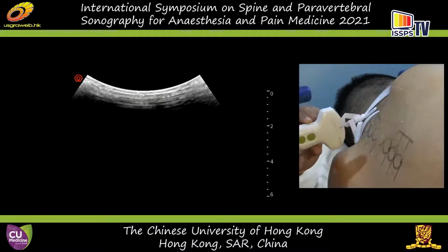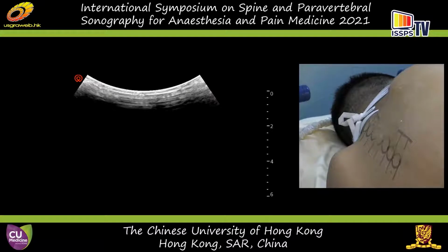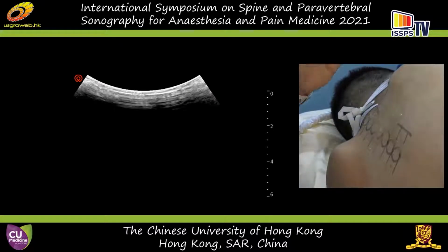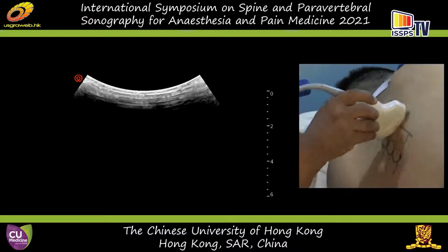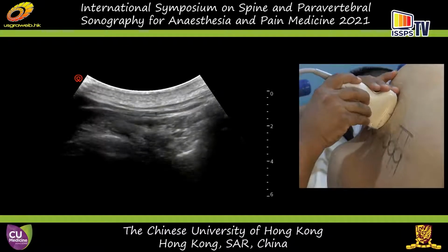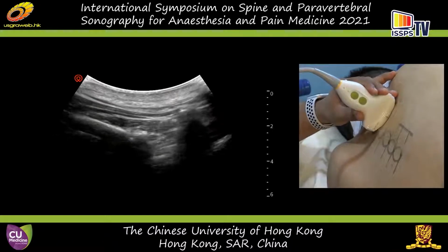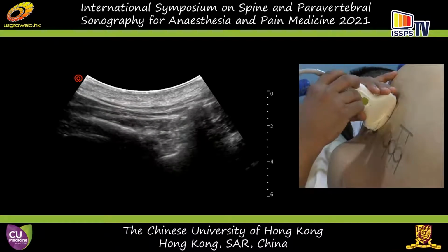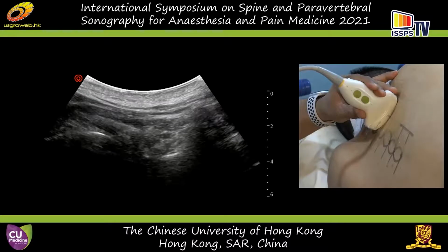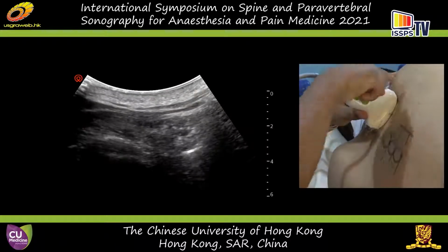We are going to do the scan at the mid-thoracic level. For your orientation, the orientation marker is to the top left and will represent lateral. So any transverse scan you see, that'll be lateral. And obviously anything closer to the probe is superficial. So I'm now going to place the probe transversely, and we'll offset it so that we are seeing mostly the right side. As you can see here, Ranjit, can you focus down there? Yeah, very good. Now, the orientation marker is lateral here, okay?